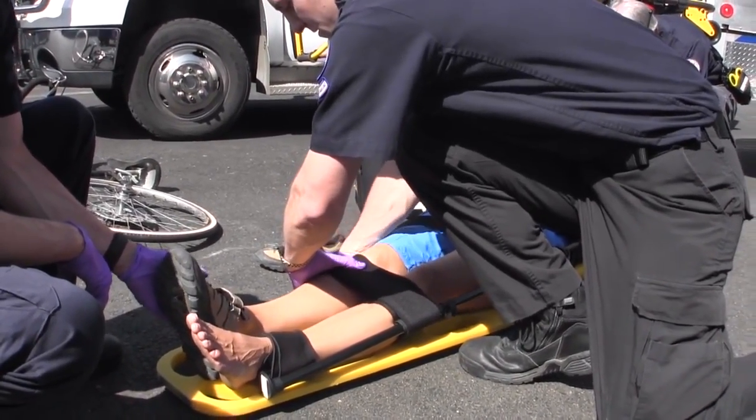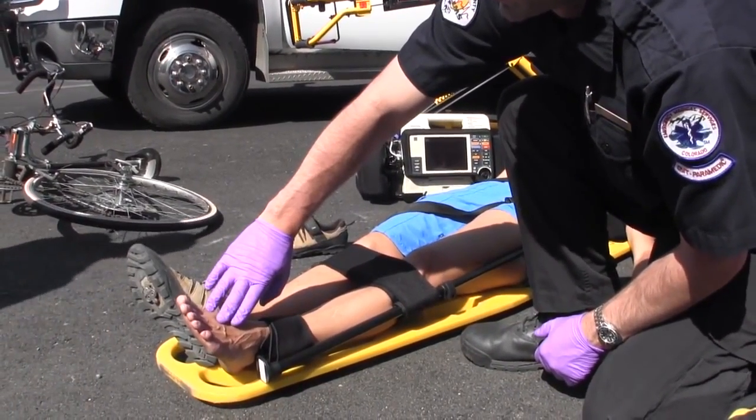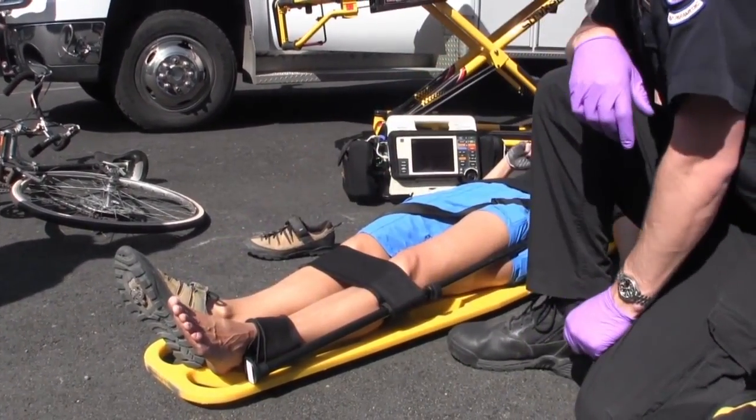The patient is now packaged for transport. Note that in the event of a concurrent ankle injury or even a foot amputation, the ankle strap can be applied proximal to the calf and femoral traction can still be accomplished.